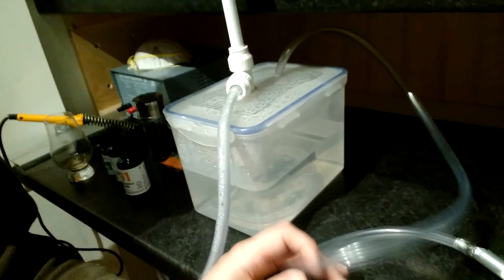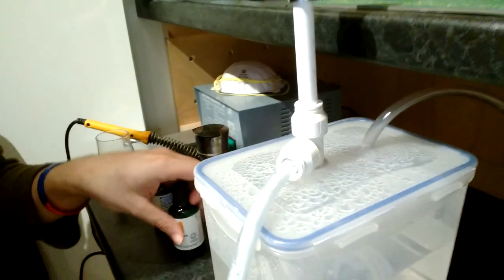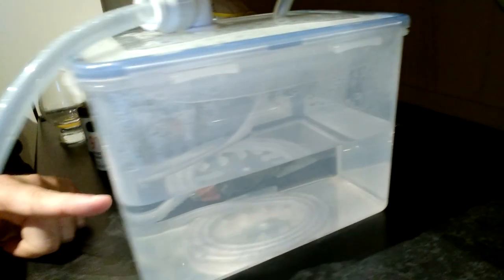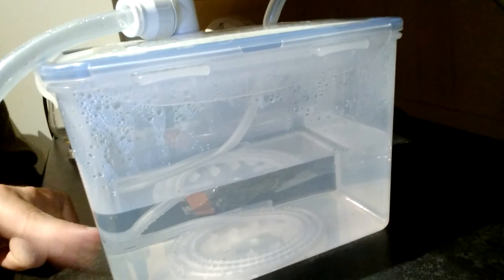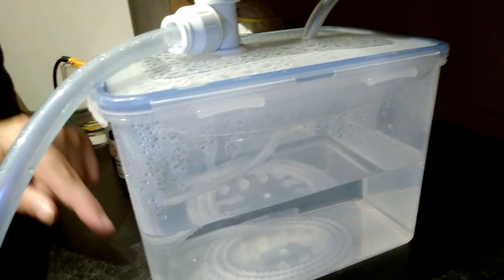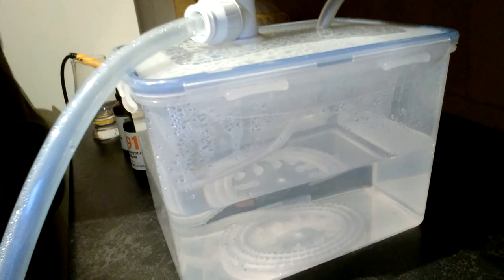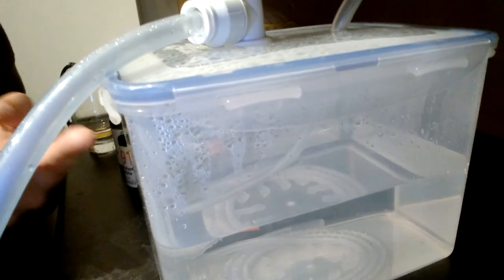Output from here goes into some poly tube, which then comes up around the back, connects in here to a little spiral of slightly smaller tubing, which has a load of holes pierced into it, so that the air which comes in under pressure can bubble up through the water, picking up vapor from the water and additionally any essential oils or medication that you add to it.